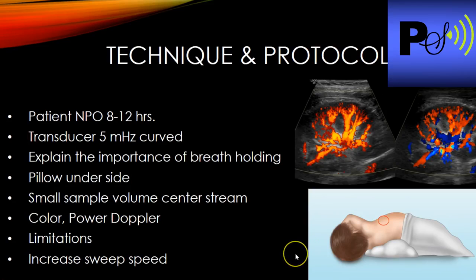Okay, so technique and protocol. You want the patient to be NPO. Of course, in an ideal world, that's how you will get the patient, but a lot of times you won't get a patient that's NPO. But the patient should be NPO for 8 to 12 hours.